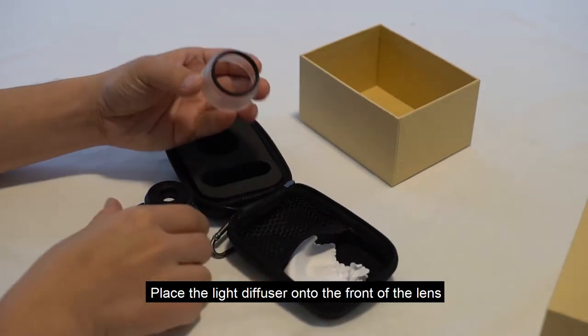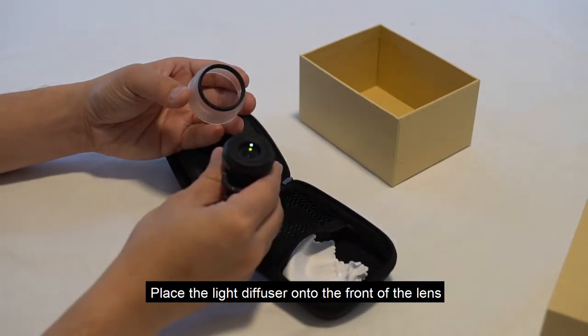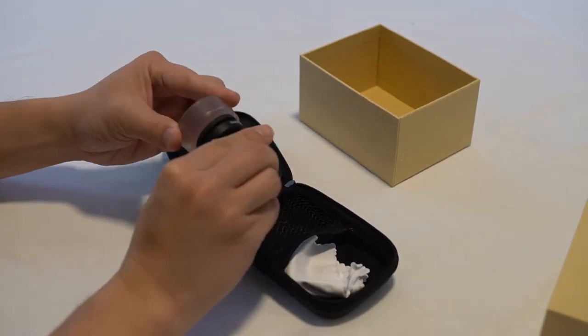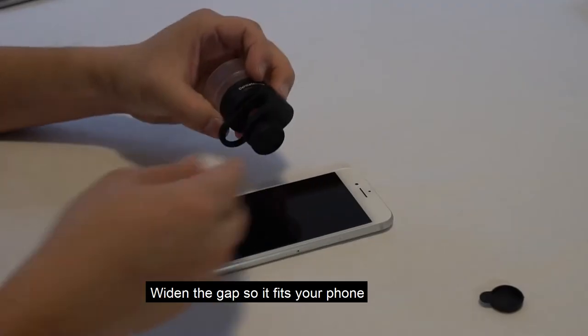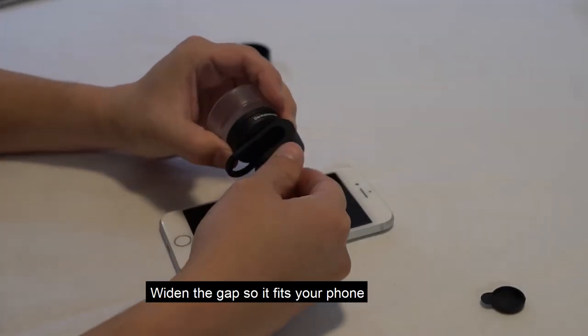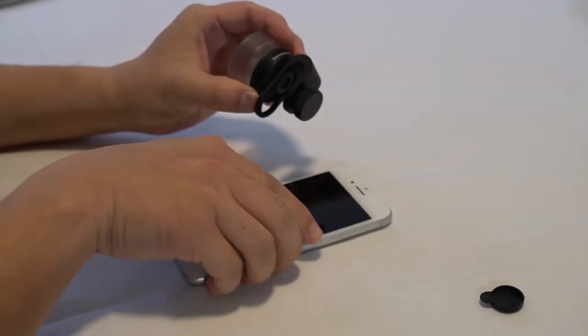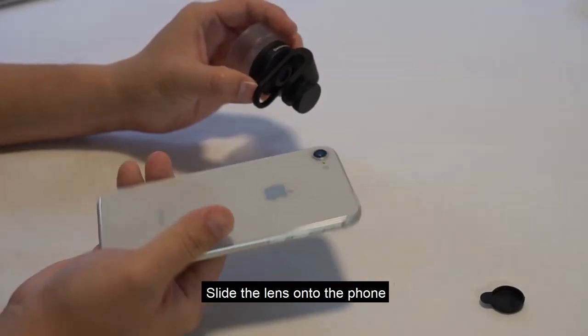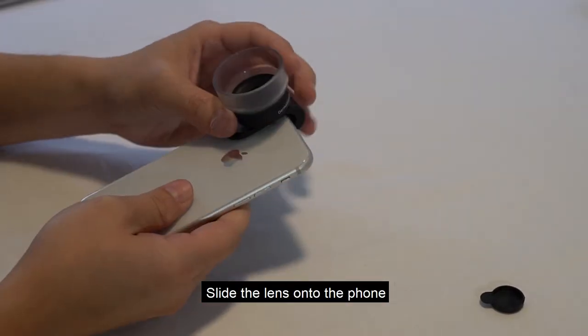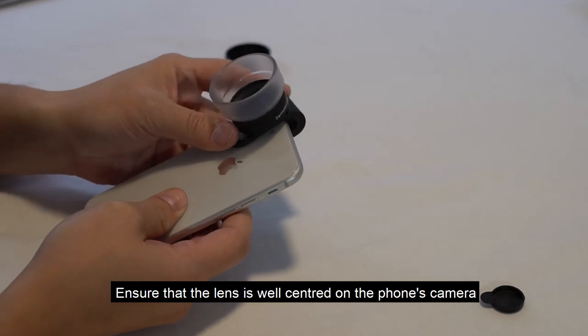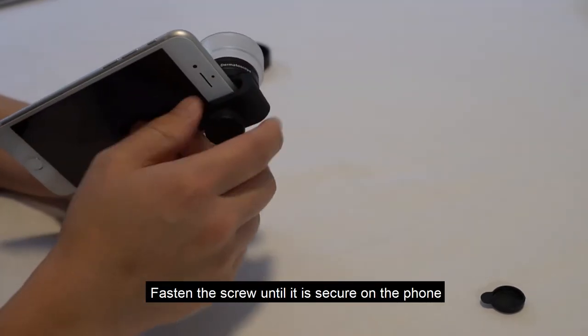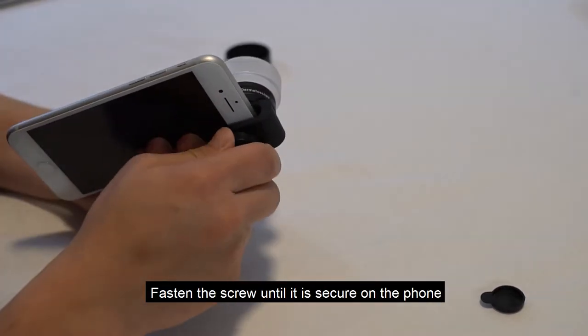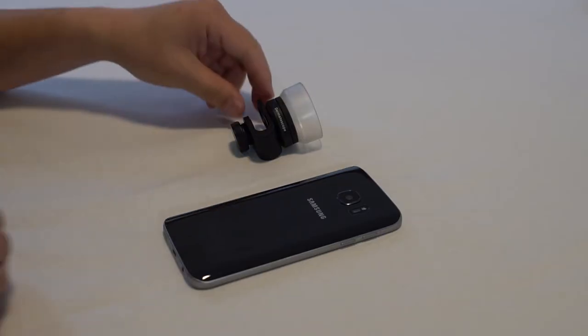Place the light diffuser onto the front of the lens. Widen the gap so it fits your phone. Slide the lens onto the phone. Ensure that the lens is well-centered on the phone's camera. Fasten the screw until it is secure on the phone.